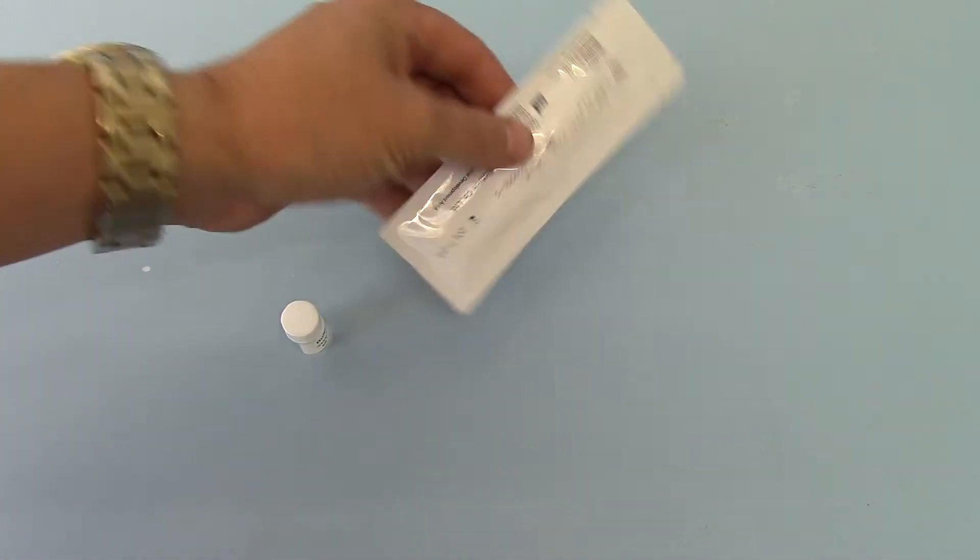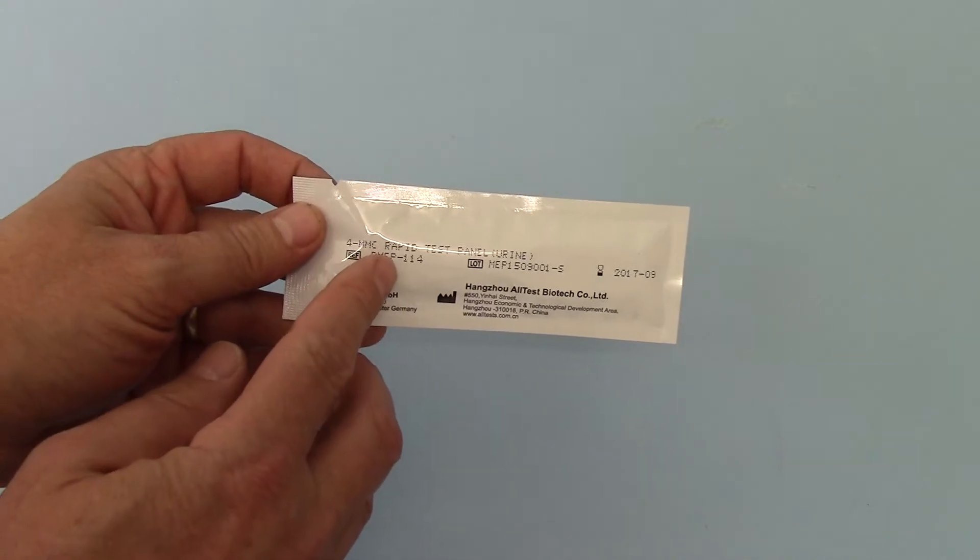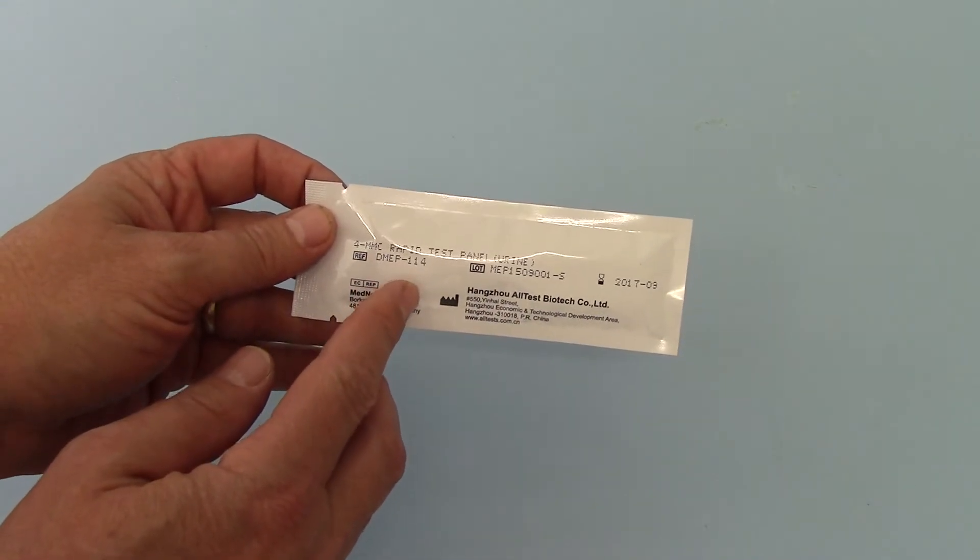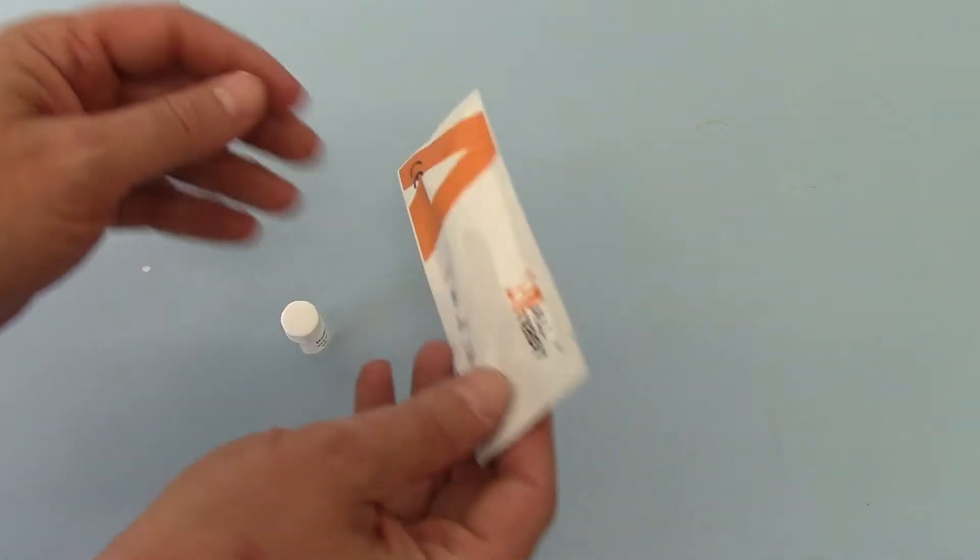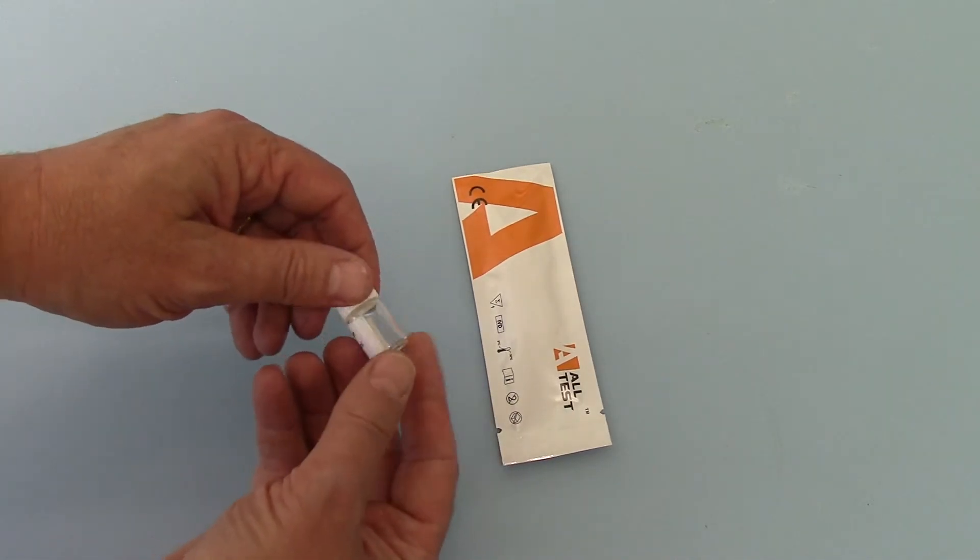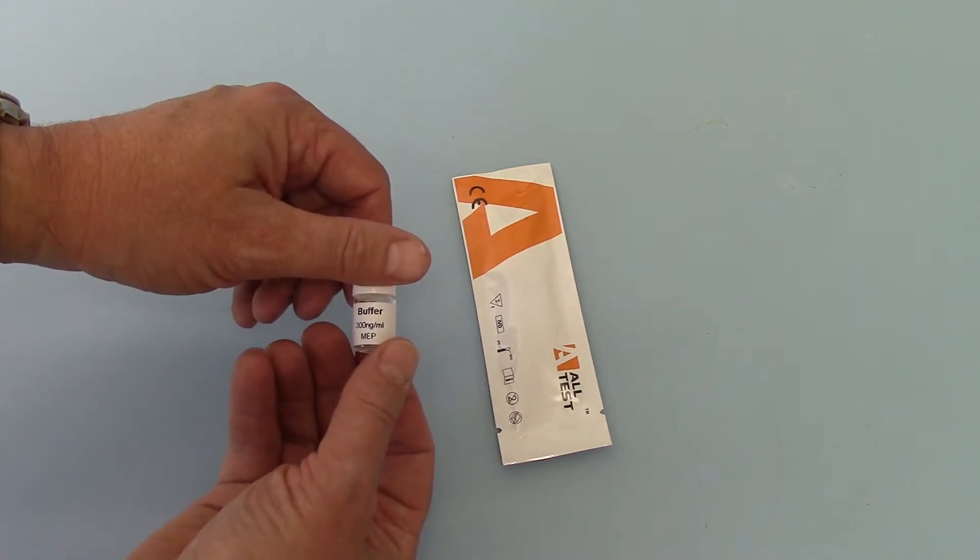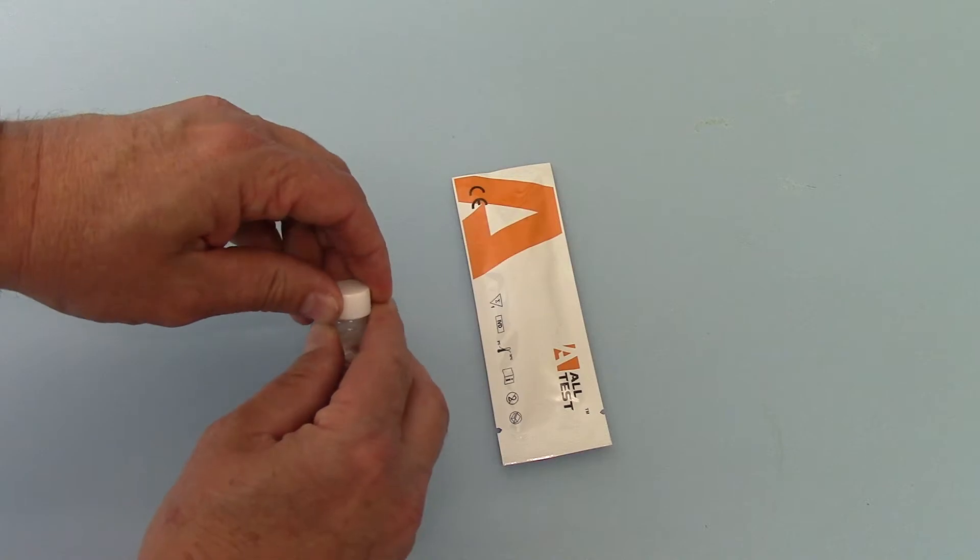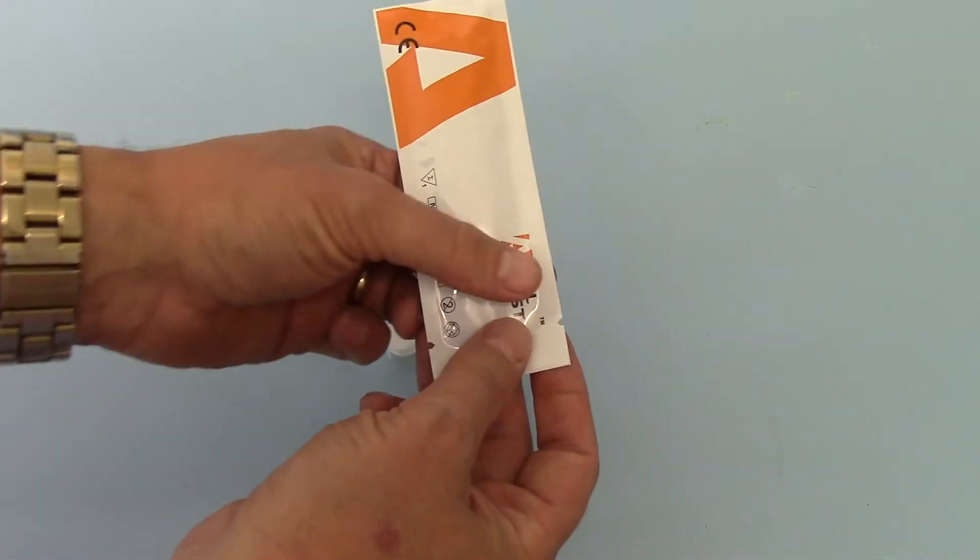So what we have here is the new test 4-MMC rapid test panel. They've just come in from AllTest being designed specifically for us and this is a mephedrone 300 nanogram buffer control that we're going to actually run the test on.